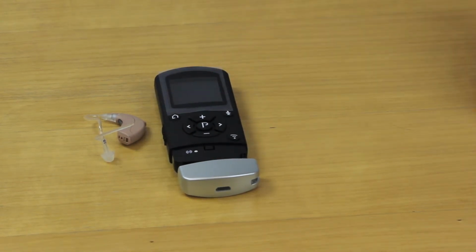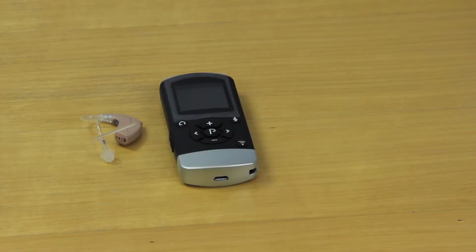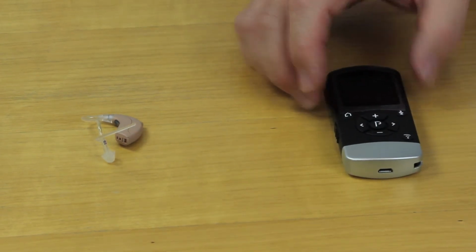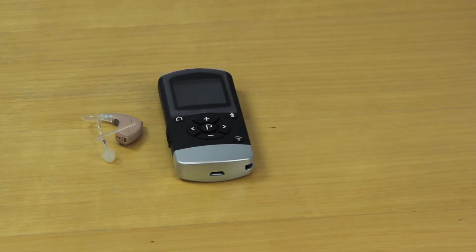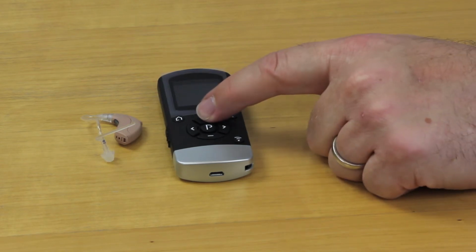The operating range between the Remote Control 2 and the hearing instrument is approximately 100 centimetres. Using the remote within this range, the following options may be activated. To change volume, use the plus and minus keys.